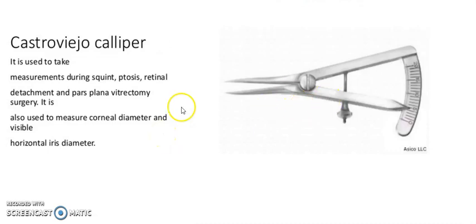It is a Castroviejo caliper. It is used to take measurements during squint, ptosis, retinal detachment, and planning of dacryocystorhinostomy surgery. It is also used to measure corneal diameter and visible horizontal iris diameter.